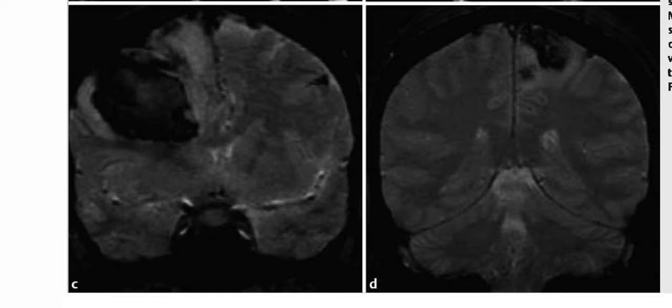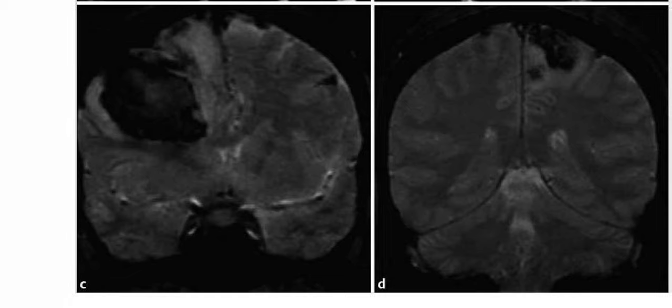MR venography revealed absence of normal flow signal within the superior sagittal sinus. The key imaging finding is intraparenchymal hemorrhage. The top differential is hemorrhagic venous infarct. Other differentials include vascular malformation, contusions, cerebral amyloid disease, and hemorrhagic tumors such as GBM. This is a confirmed case of hemorrhagic venous infarct.